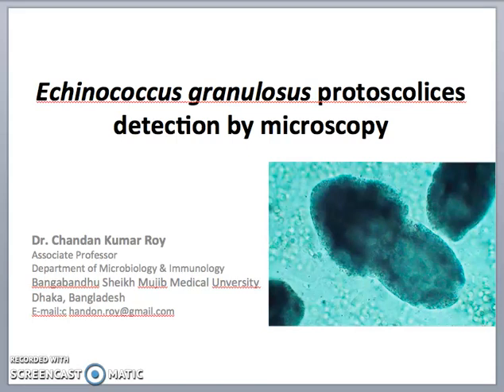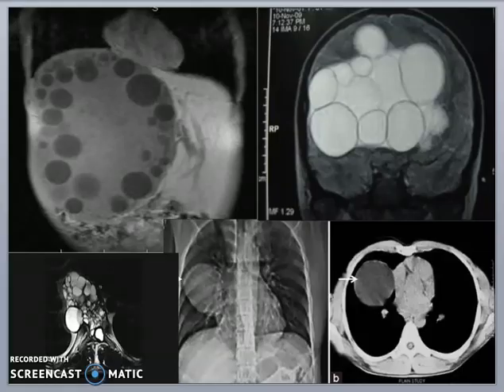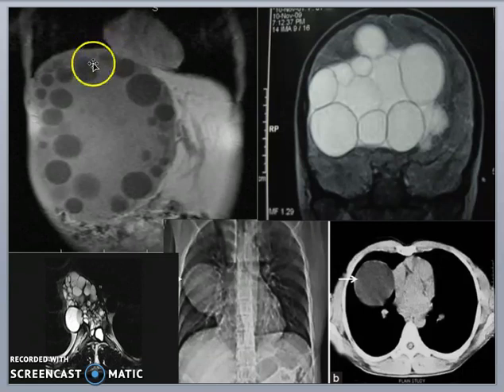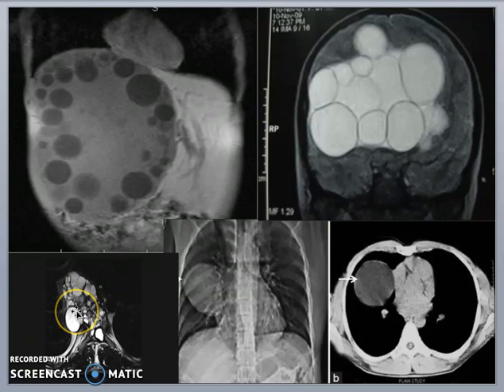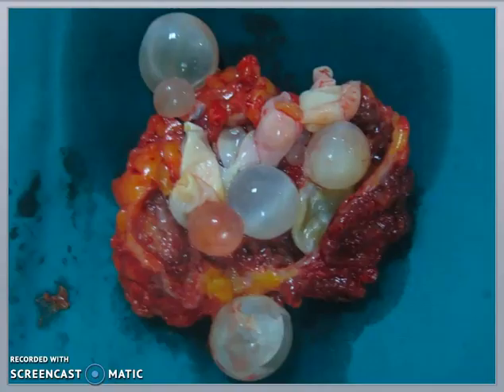Echinococcus granulosus is a parasitic tapeworm causing human cystic echinococcosis, or hydatid cyst disease. Radiological examination of such patients may reveal cystic lesions within the liver, lungs, central nervous system, or in the paravertebral region. This video demonstrates the surgical removal of the cyst from pulmonary tissue.